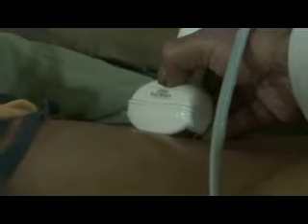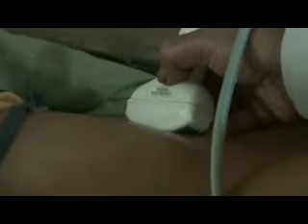Now again, this is the epigastric region. This is the subcostal margin. I will place the probe here, and then I will angle towards the axilla of the patient, and with a little bit of pivoting and maybe having to go upwards a bit, I will try to get the gallbladder in longitudinal section, because in this view you will not be able to miss any calculus if it is in the region of the fundus. And so let's try it on the patient.